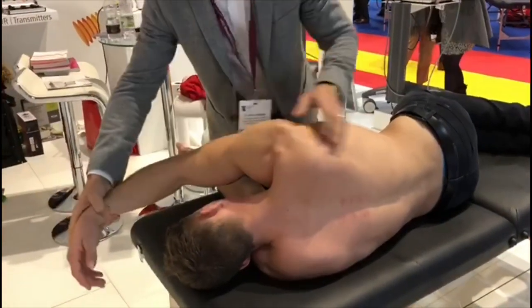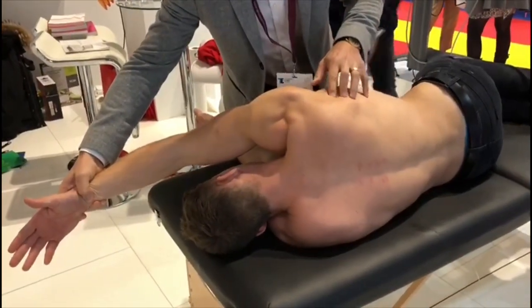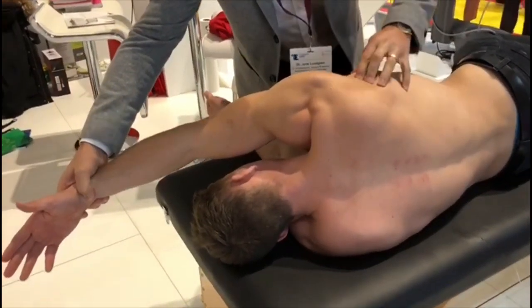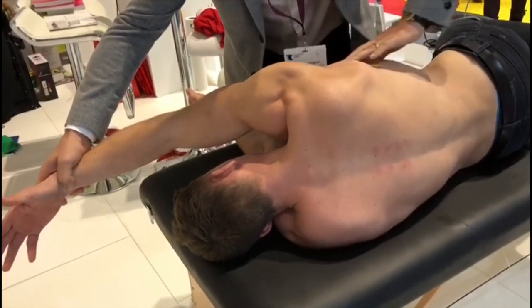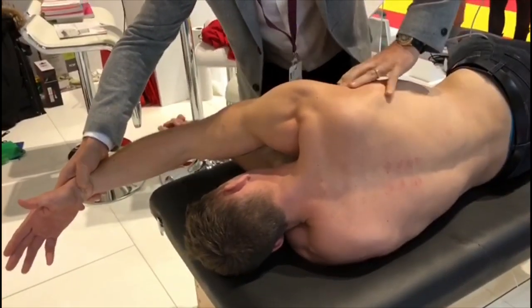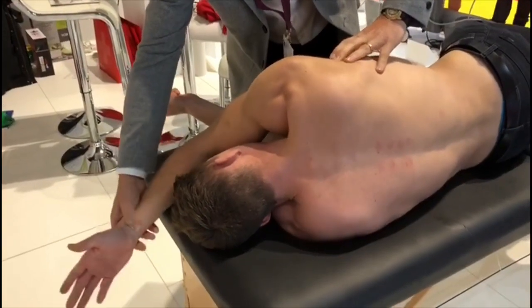Let's put your thumb facing upwards like that instead. And now it's a little bit intense. So this is probably the weak spot, the tight spot. I would say this region here. Not too bad here, but in between this would be. Is this painful? It's okay. All right. Can you rest your arm like that?